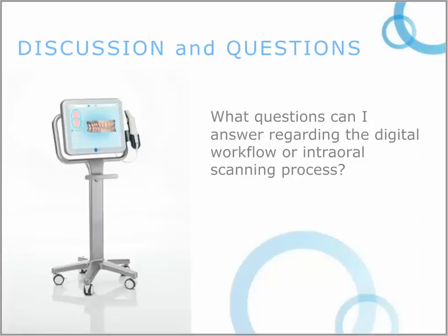And the answer is you need to look and see what the return on investment is for in-office milling. As far as a 3D printer, I think it has three different properties that are valuable to a general dentist. One, it can make models, and on those models we can do all the things that we ordinarily do out of stone. However, we do it with a material that doesn't break like a stone model, and a material that's much more accurate.